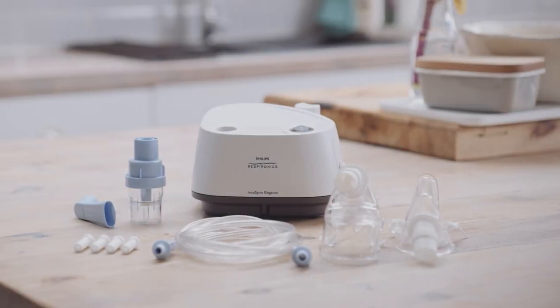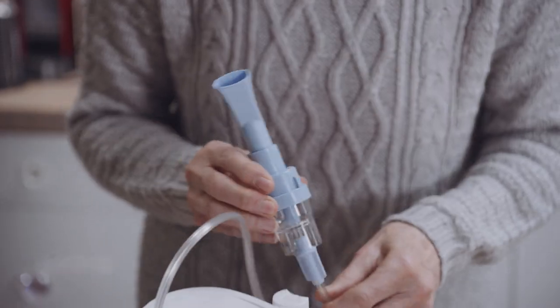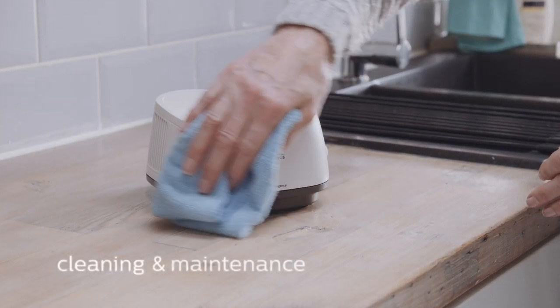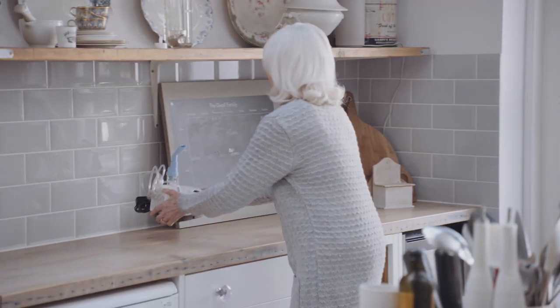This video shows the different steps to using the Philips Inaspire Elegance Nebuliser Compressor, including setting up the Sidestream Nebuliser, preparing the medication, taking a treatment, cleaning and maintenance of the product, checking and replacing the filter, as well as storage between uses.